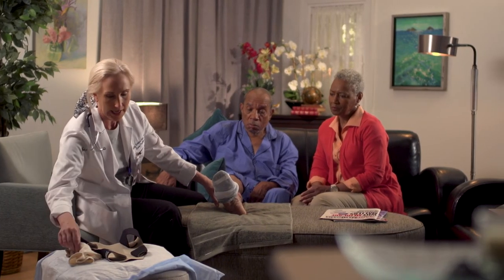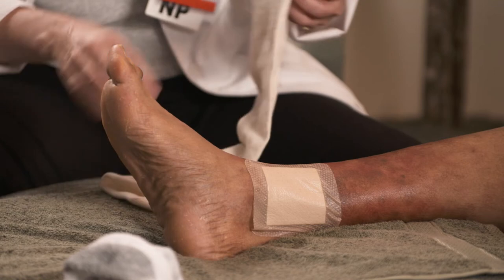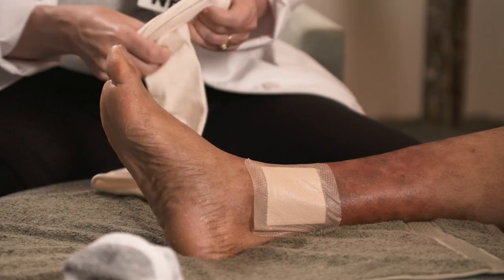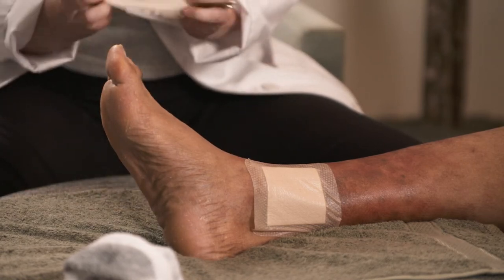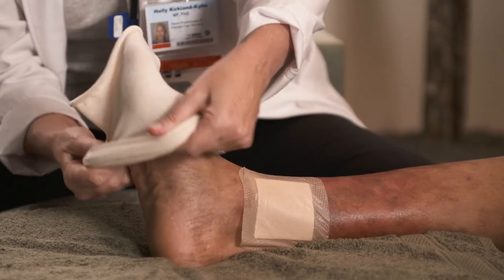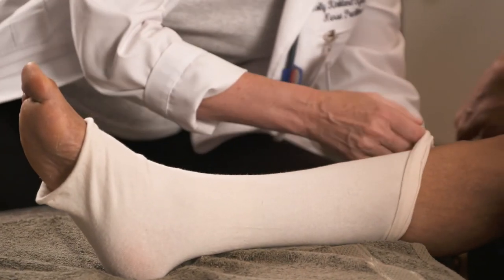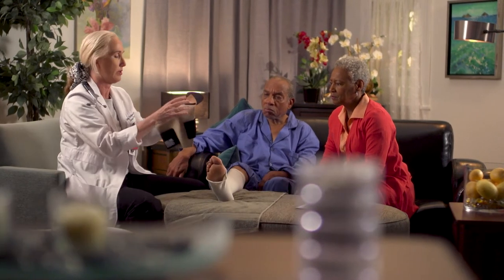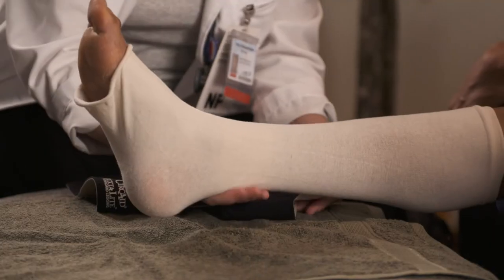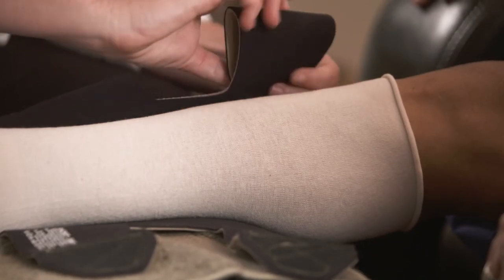Next, I'm going to show you how to apply this compression, and I know it's different from what he had in the hospital. The one she put on in the hospital really looked complicated. This part goes on first — it doesn't apply a lot of compression, it goes on mostly to protect the rest of his leg. You want to just put this on, slip it over like you would a sock, and pull it up to his leg. Make sure you get all the wrinkles out of it. Then there's this other compression part — you put the black side towards his skin and line it up with his leg. And you just cross them over.